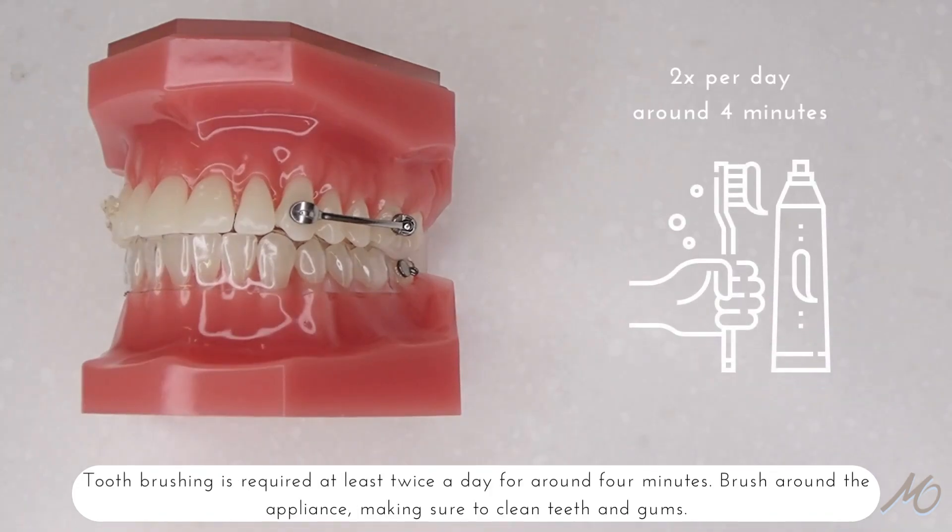Toothbrushing is required at least twice a day for around four minutes. Brush around the appliance making sure to clean the teeth and gums.